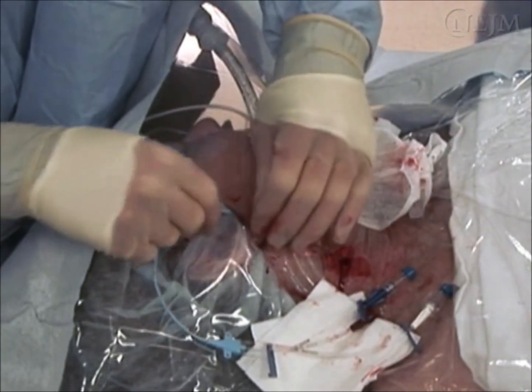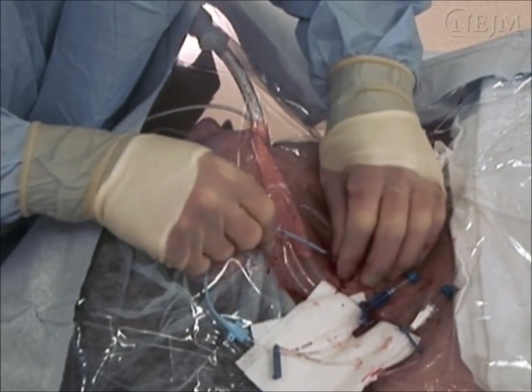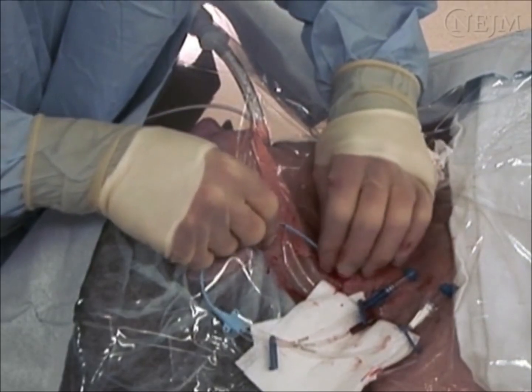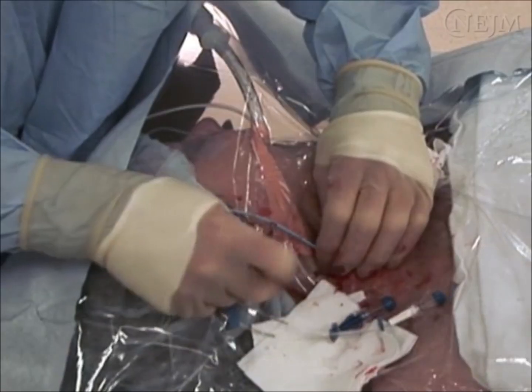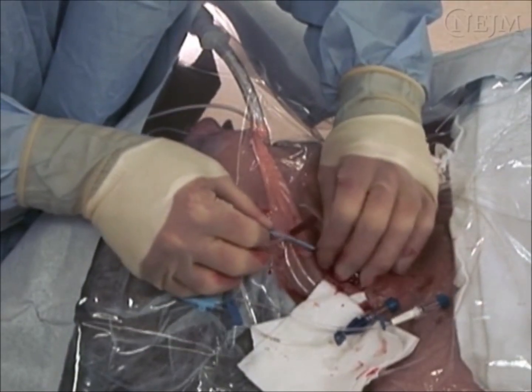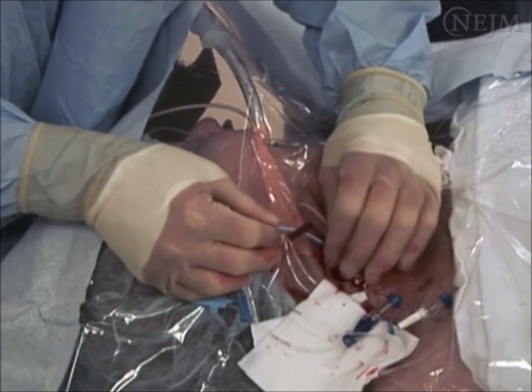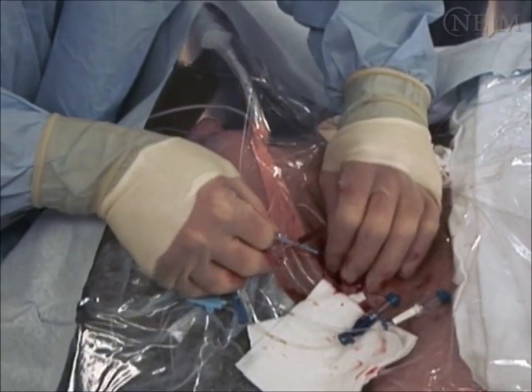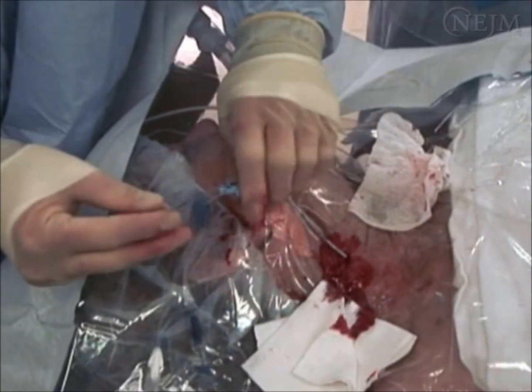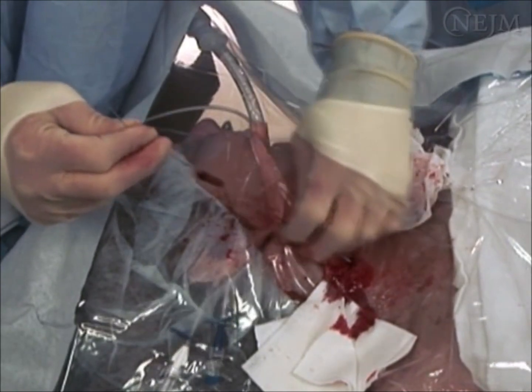Now, feed the catheter over the guide wire, being certain to maintain control of the external end of the wire before advancing the catheter through the skin. This usually requires that the wire be pulled slightly out of the patient until the external end of the wire extends out of the catheter hub and can be grasped. While grasping the external end of the guide wire, advance the catheter over the wire using a rotating motion.